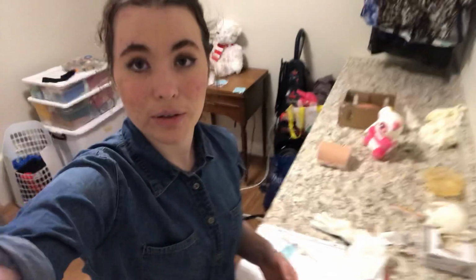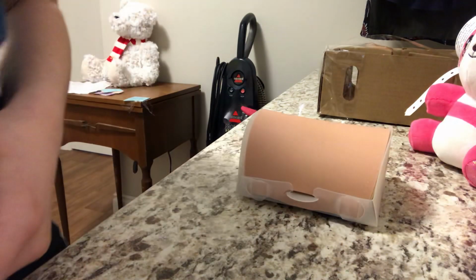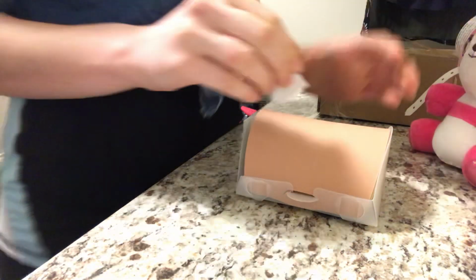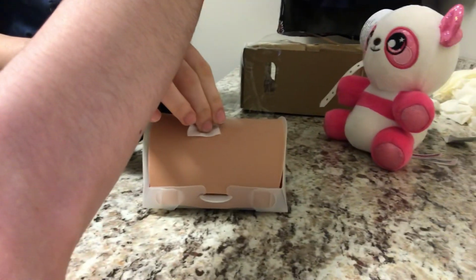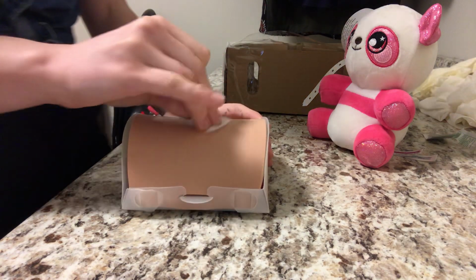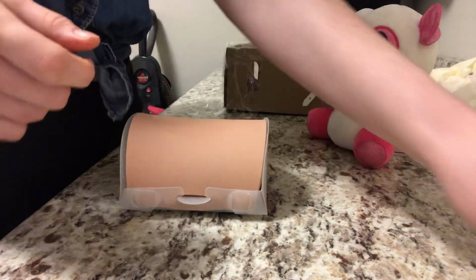So I'm going to bring this down. Please don't fall. Okay. And so I am going to perform hand hygiene, and then I'm going to take an alcohol swab, and I'm going to take the site that I landmarked, and I'm going to wash it in a circular motion for 30 seconds. Let's just adjust it a bit. And so for this, I actually like to put my gloves on after, because otherwise I find my gloves just get too slippery, and then it's hard to stabilize later. So now I'm going to discard that, and I'm going to put on my gloves now.